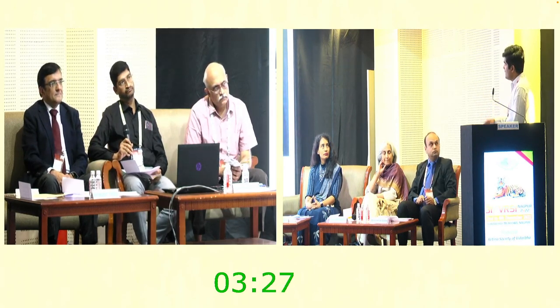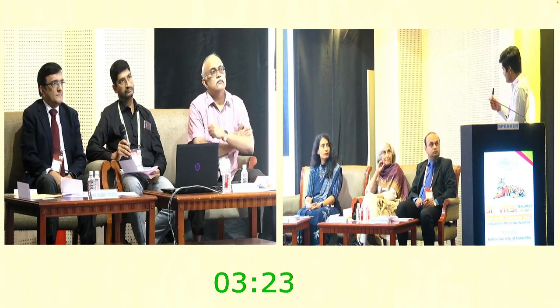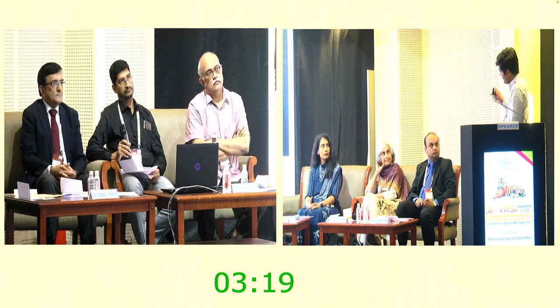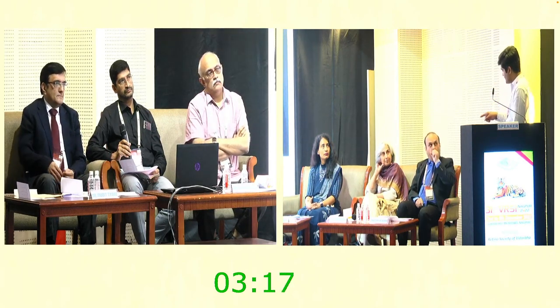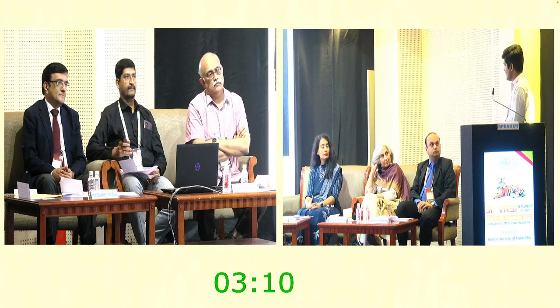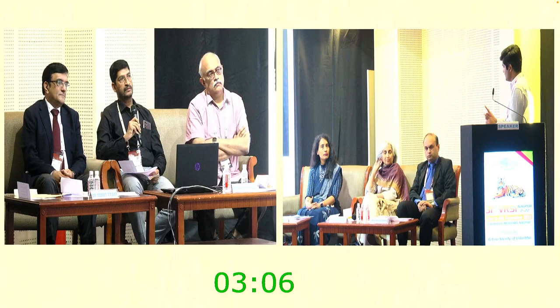And why I gave it after giving an intravitreal injection: you can see that when we give the intravitreal in that particular patient, similarly, when I give a suprachoroidal and if I had inadvertently breached the sclera, it would have been visible. So that was the reason for the demonstration. I gave the intravitreal and him sitting only, so that if there is a breach, it would have been visible.